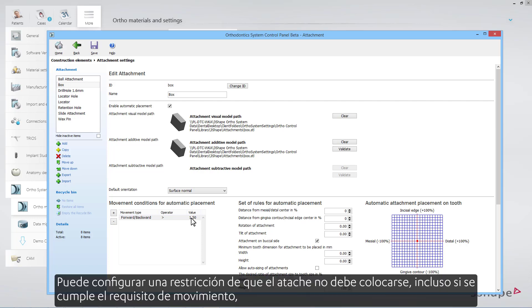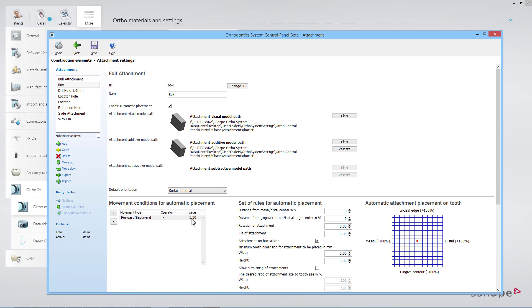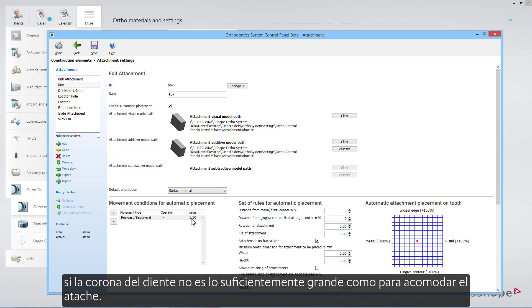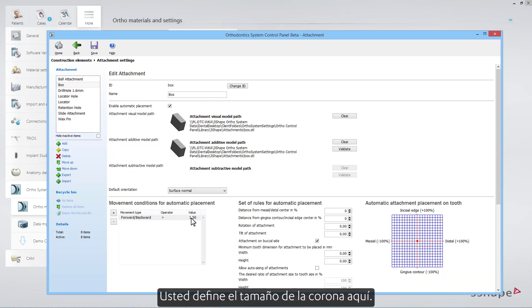You can set up a restriction that the attachment should not be placed, even if the movement requirement is fulfilled, if the tooth crown is not big enough to accommodate the attachment. You define how big the crown has to be here.